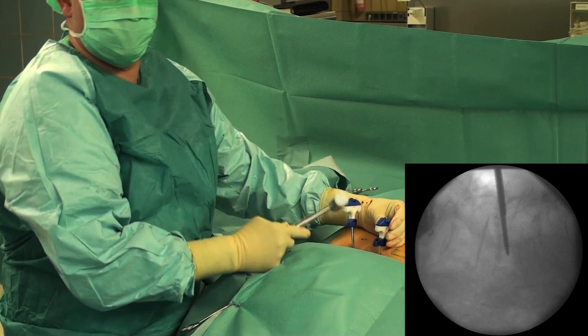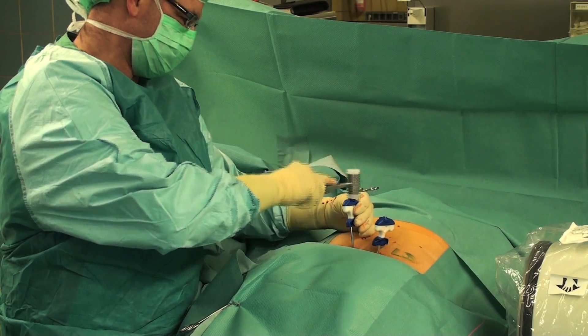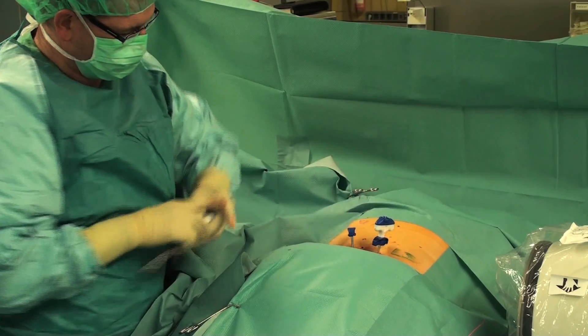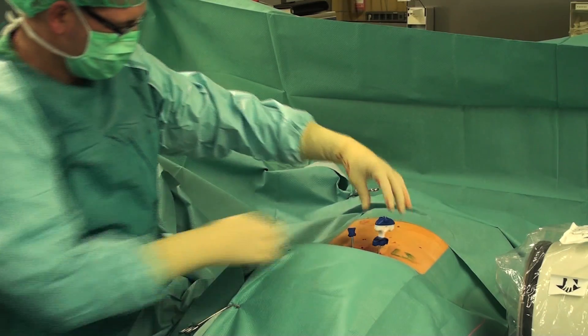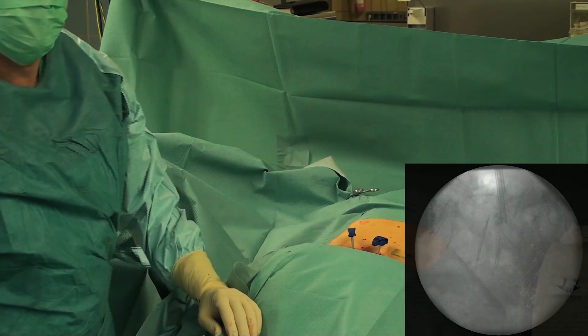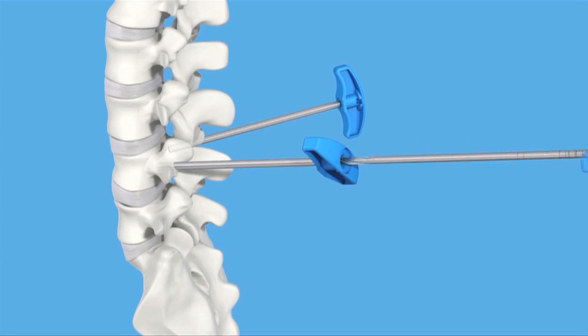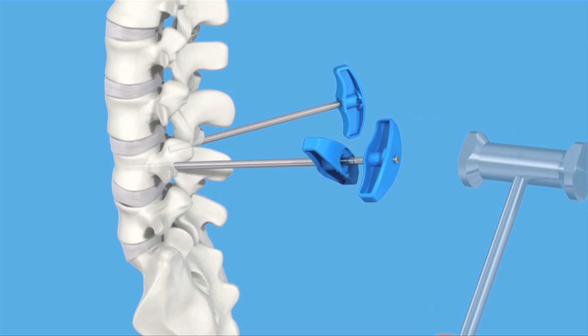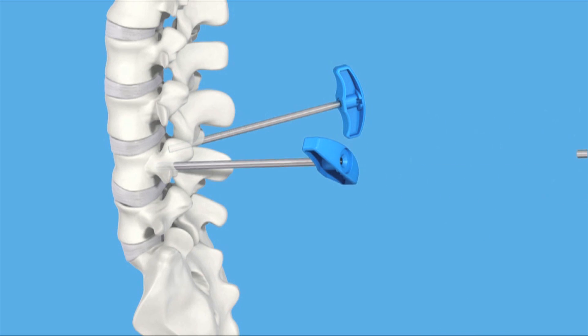The position of the instrument is being checked under AP and lateral view in X-ray. It is important to insert the instruments far enough into the vertebral body so that the outer access cannula is securely positioned inside the vertebral body behind the posterior wall of the vertebra. After positioning of the access cannula, the access channel for the stent needs to be prepared. Therefore, first the drill and second the blunt plunger is used. The procedure must be done under radiographic control to avoid penetration of the instruments through the anterior cortical vertebral rim.